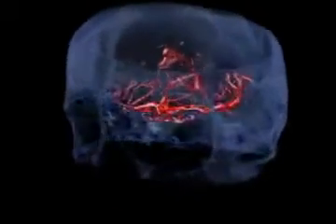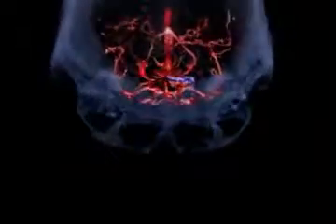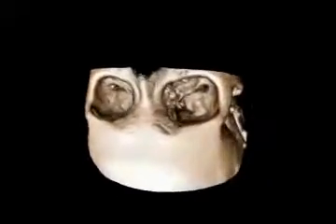And we could turn the skull however we wanted, except we couldn't do it ourselves, so it was not interactive. It's beautiful imaging, and we thought this was the right idea. And this is volumetric rendering, not surface. But there was no one-to-one interactive feedback, and it would take us a week or more to be able to generate these images.